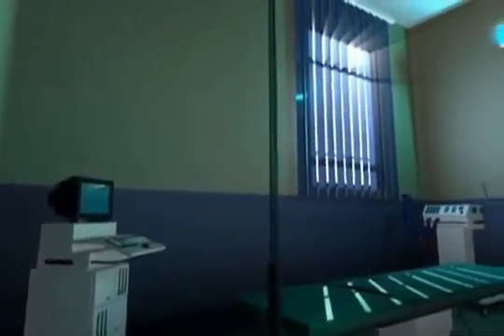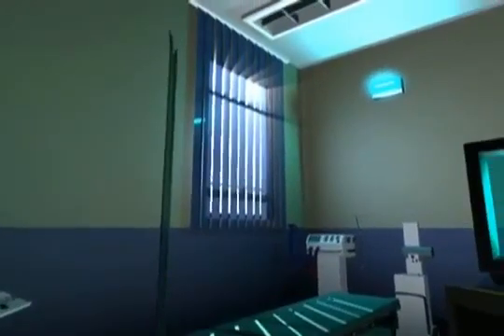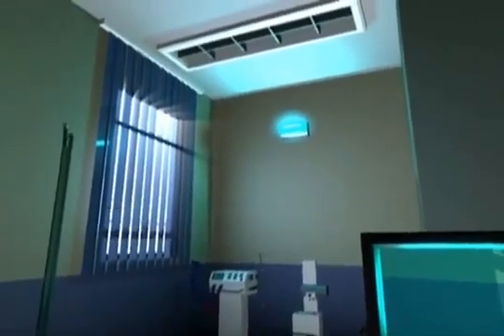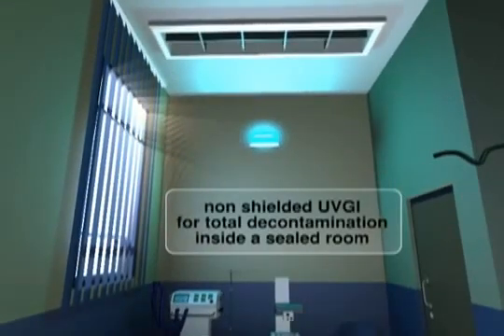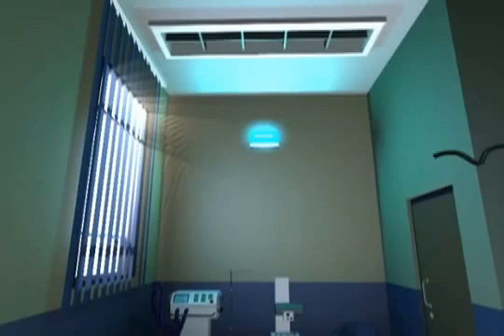Besides the upper air solution, it's also possible to use a special UVC lamp application. For example, quarantine rooms can be cleaned between patient occupation by radiating the empty room with lamps in a configuration that ensures concentrated radiation of the walls and equipment. During this process, no one is allowed in the room being treated.